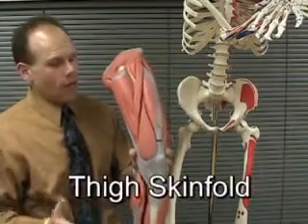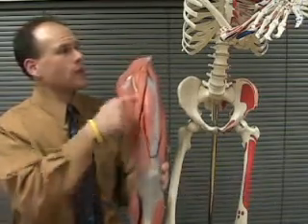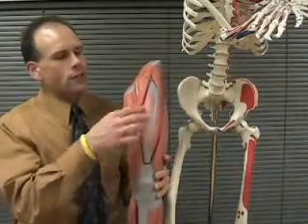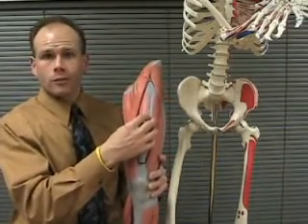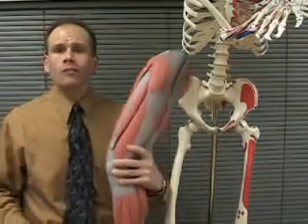So for example, the thigh measurement is halfway between the proximal patella and the inguinal fold, or the fold that's created when someone raises their leg. We're going to look at the superficial skin fold halfway between those two locations. It'll be right over the rectus femoris muscle. We're going to try to pull the fat away from the rectus femoris.